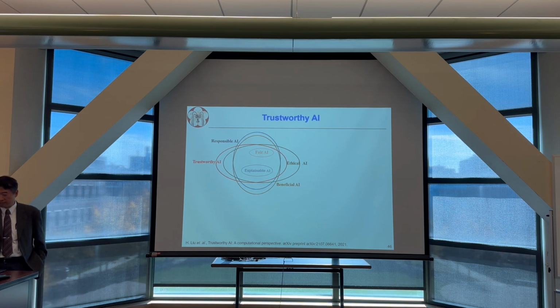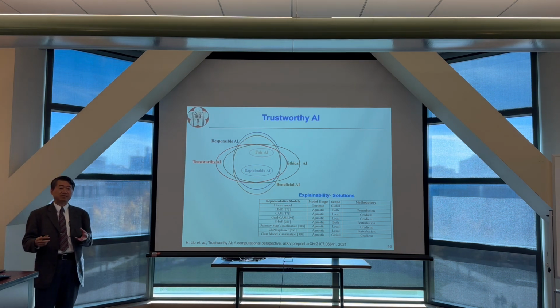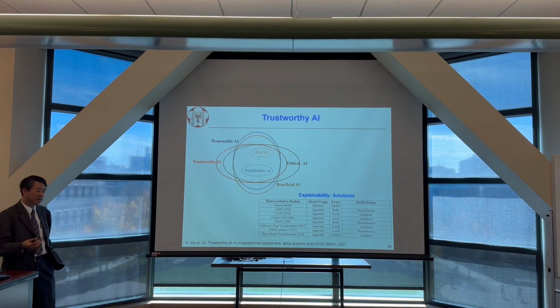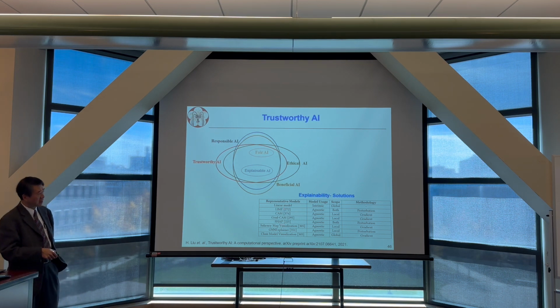Fortunately, these days there are many algorithms that people develop to help people understand what this kind of black box is really doing to give you results. Remember, I already showed you one example, the heat map. The heat map only shows you the region where the hot spot is, but there are many algorithms that can help people explain the result. For example, recently we tried the so-called Shapley parameter.